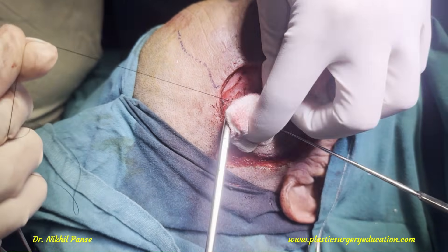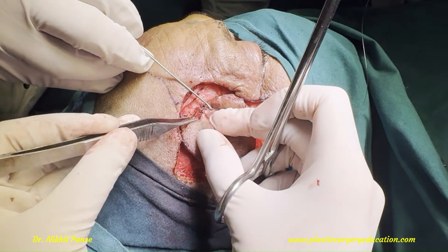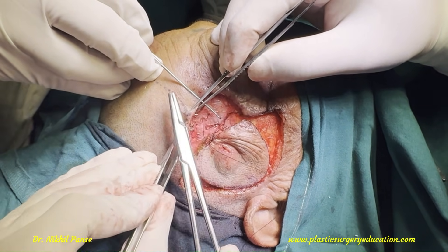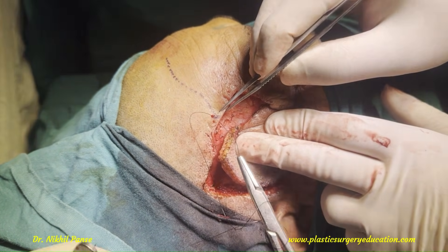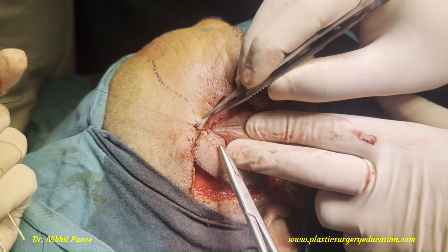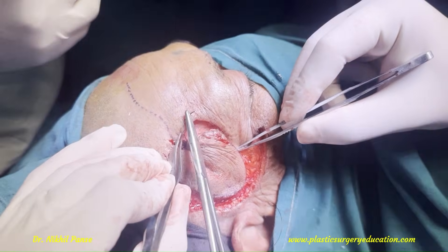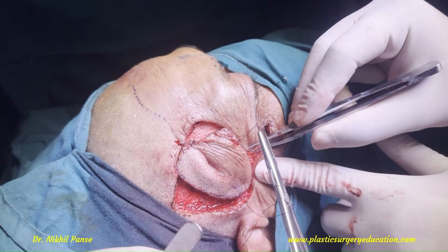After the key suture is taken, the next suturing is very critical to avoid distortion of the hairline. We have already marked the hairline and are taking sutures accordingly so that the hairline is not distorted. Considering the age of the patient and the laxity available, the suturing is tension-free and straightforward.